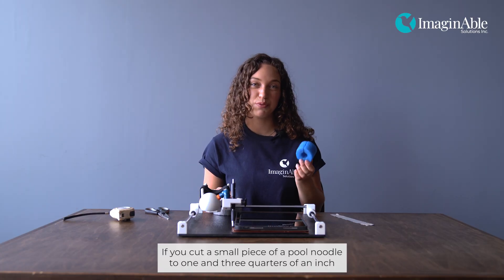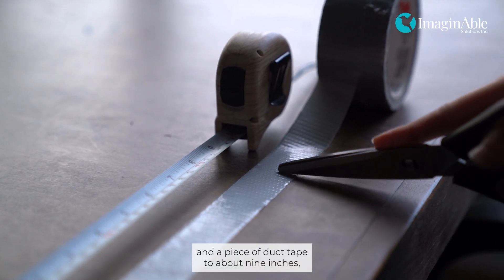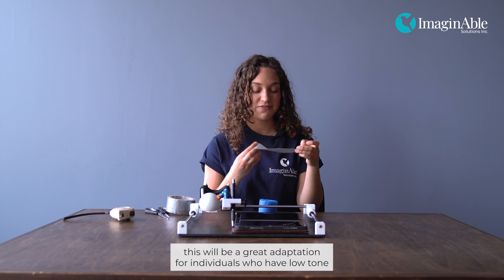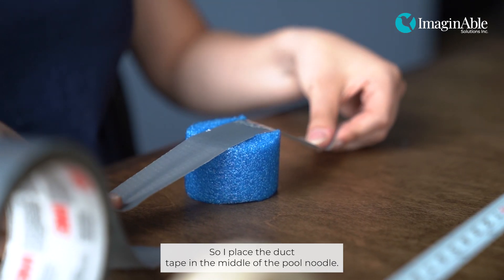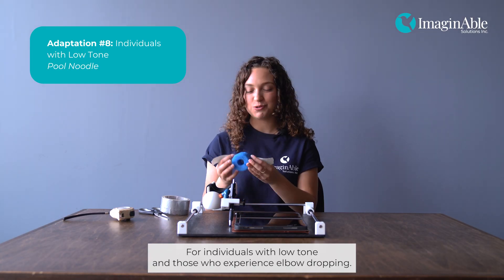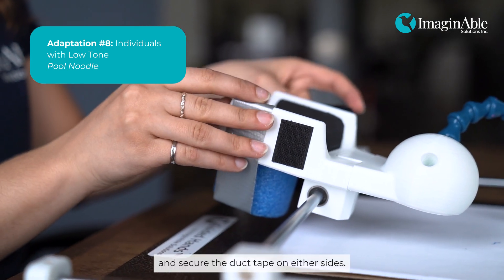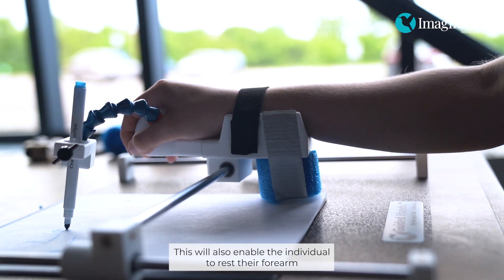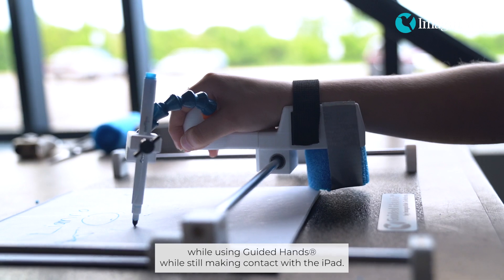If you cut a small piece of pool noodle to one and three quarters of an inch and a piece of duct tape to about nine inches, this will be a great adaptation for individuals who have low tone and high tone. Place the duct tape in the middle of the pool noodle. For individuals with low tone and those who experience elbow dropping, place the pool noodle underneath the wrist rest and secure the duct tape on either side. This will also enable the individual to rest their forearm while using Guided Hands while still making contact with the iPad.